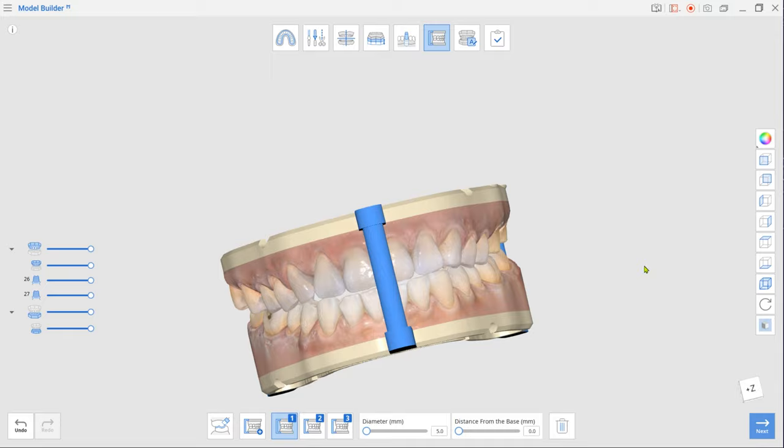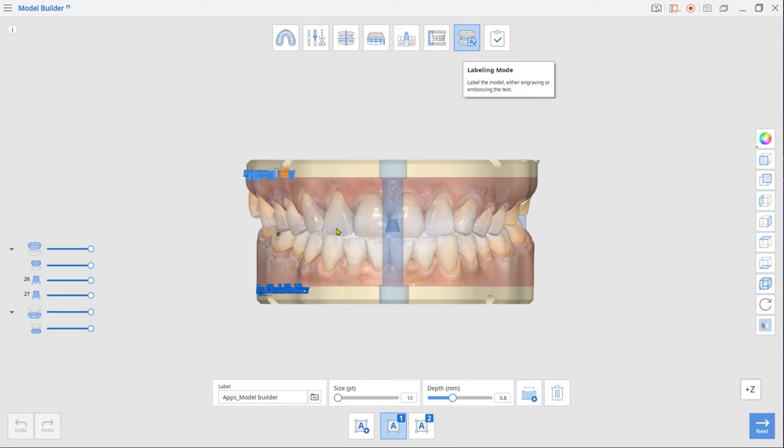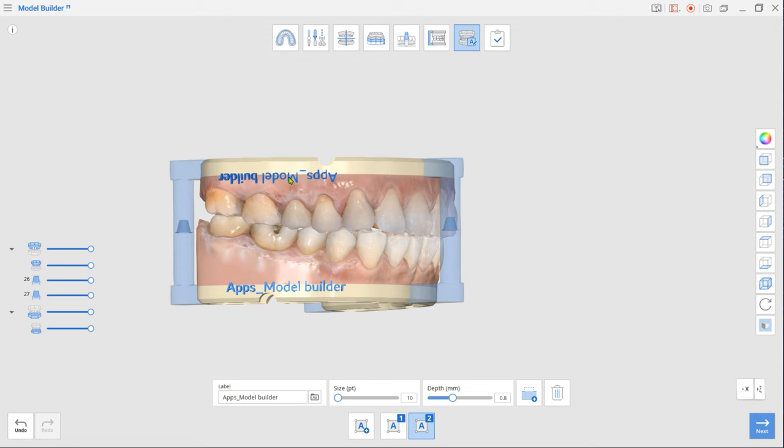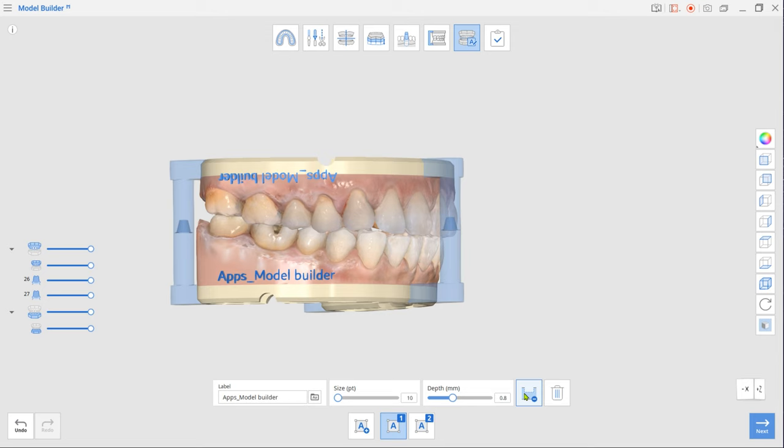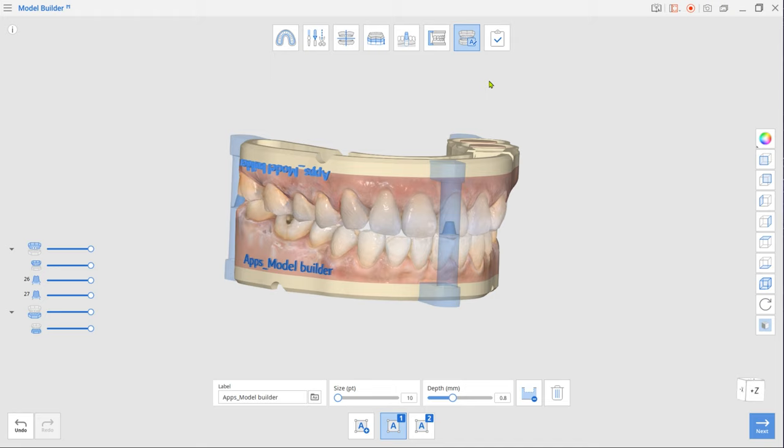Once done, move to the final labeling mode. The first label is automatically created using the case name. Drag the label to change its placement on the base. You can choose to engrave or emboss the label. To change label text, enter a new name in the label box below.